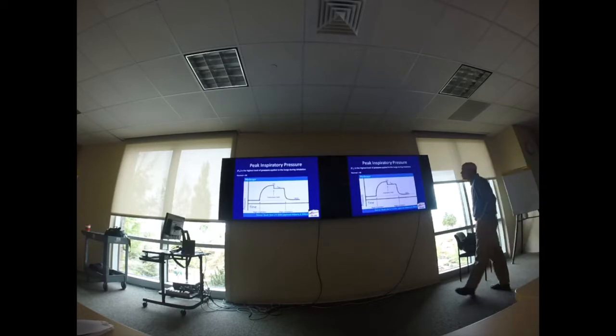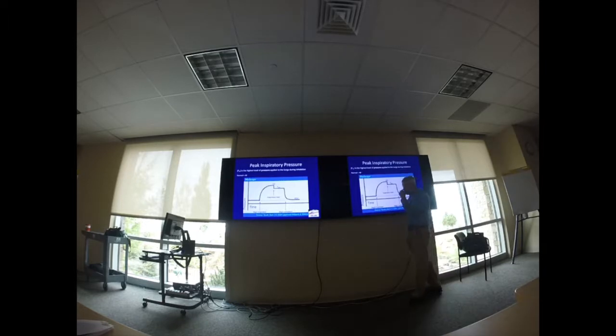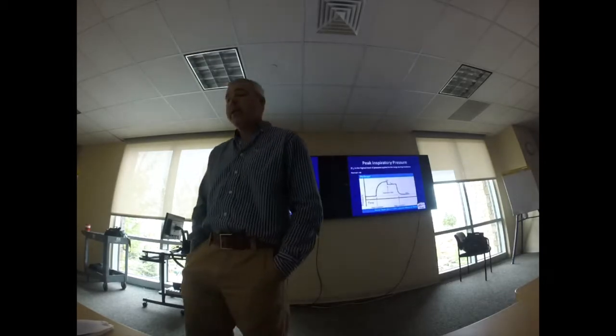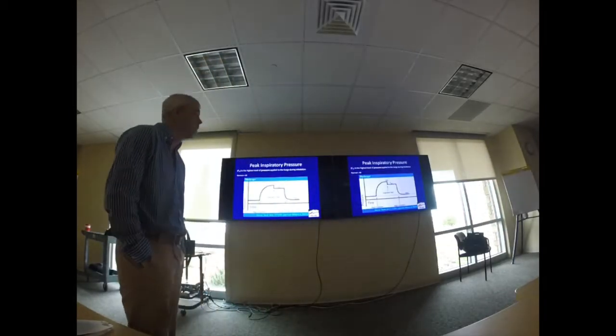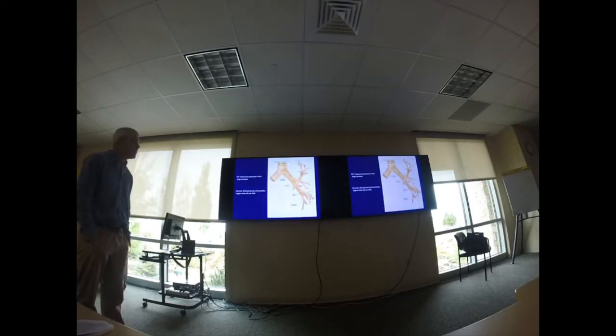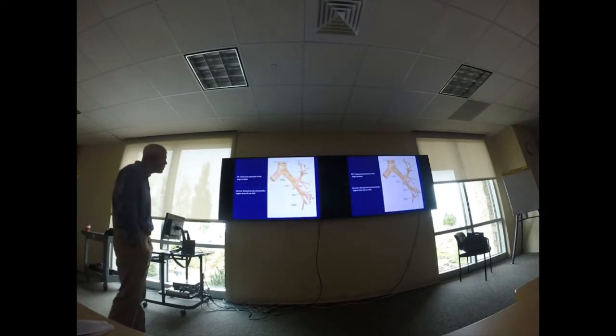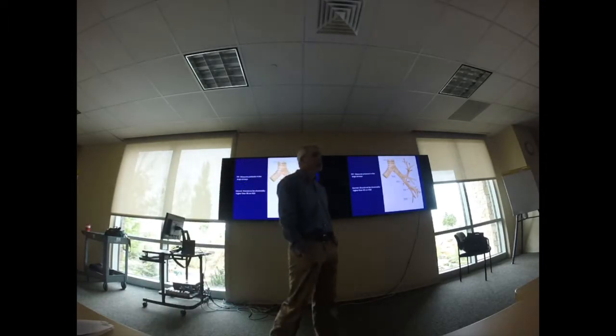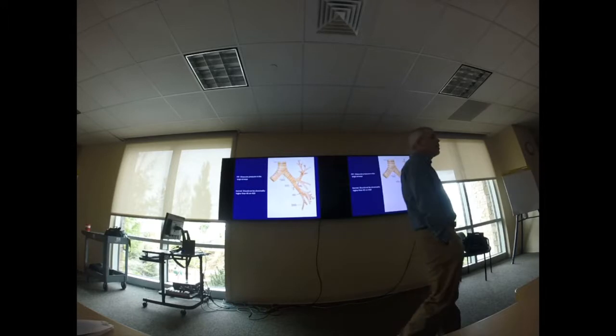So a peak inspiratory pressure that's chronically greater than 40 requires me definitely to investigate it and figure out what's going on. And really, any increase in your peak inspiratory pressure, you need to figure out what's going on with it and investigate it. Peak inspiratory pressures measure the pressure in the large airways, right? So it's not the terminal airways, it's the large airways.